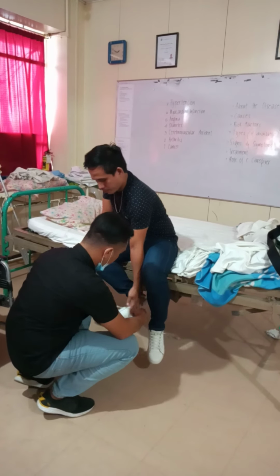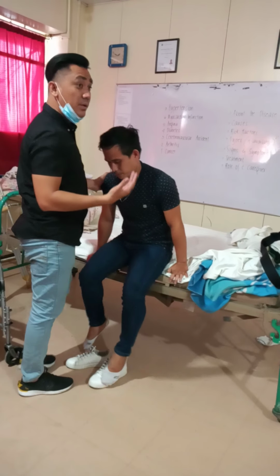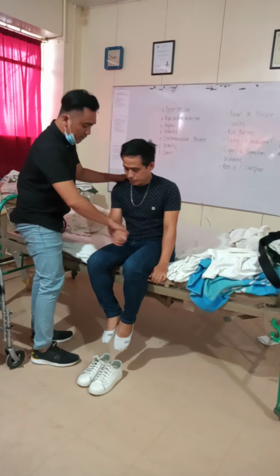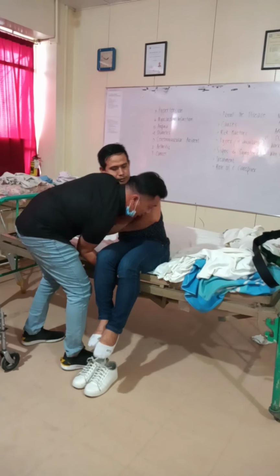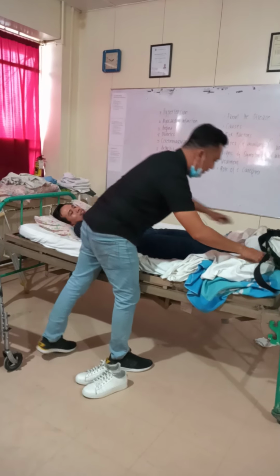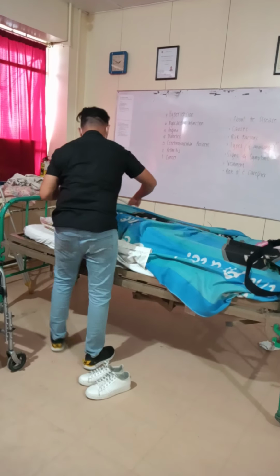Put the carrier there, sir. Okay? Then lower him down. Sir, lie down at the count of 3. 1, 2, 3, lie down. Okay? Straighten the tail, sir. Then that's it. He isn't leaning back anymore, sir.